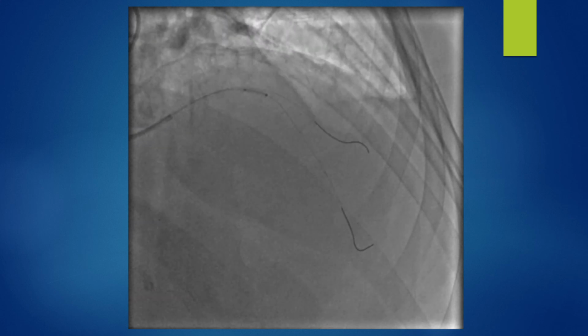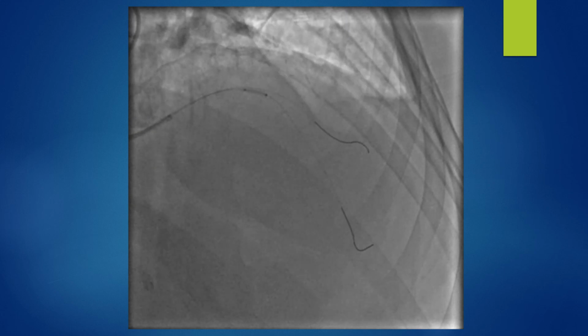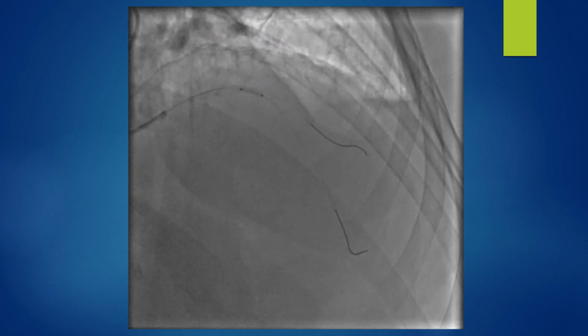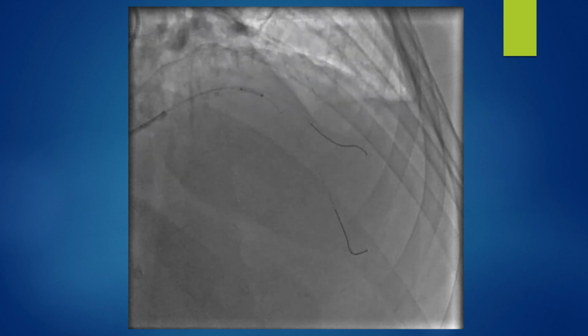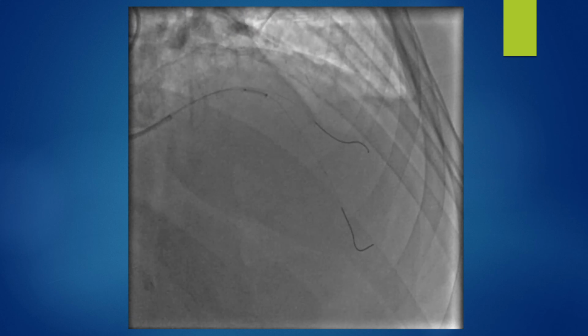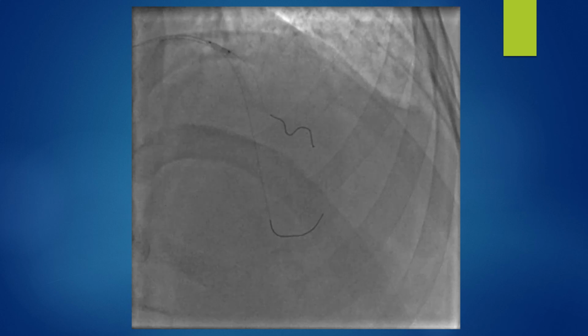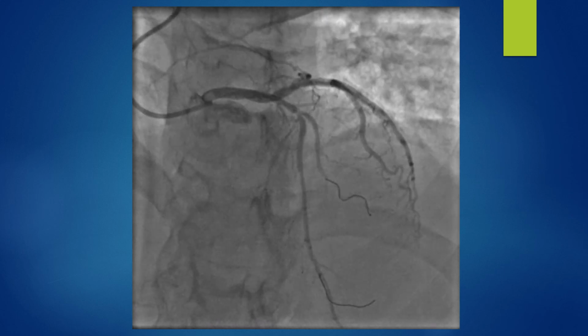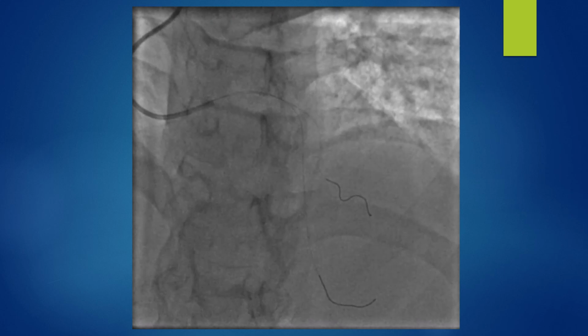I used an XB30 guide. I wired both branches, the diagonal branch and the LAD, using the workhorse wire. Then I passed a 2.25 by 10 mm compliant balloon for balloon angioplasty in the mid LAD. Then I performed a balloon angioplasty of the diagonal branch using the same balloon. This is the angiogram after balloon angioplasty of both LAD and diagonal branch.